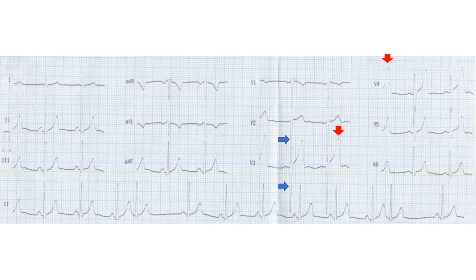This ECG also shows deep S waves in V2 and V3, which might indicate left ventricular hypertrophy. The tall T waves in V3 and V4 are more of a normal variant than what could occur in hyperkalemia and the hyperacute phase of myocardial infarction. The latter condition is often missed and mandates a repeat ECG if the clinical condition is suggestive.